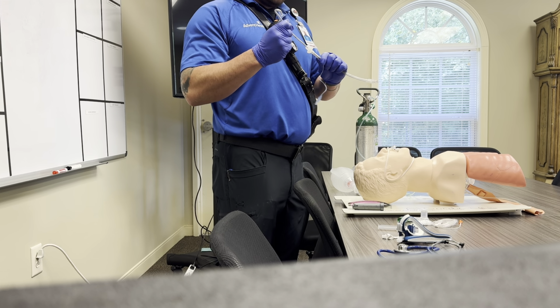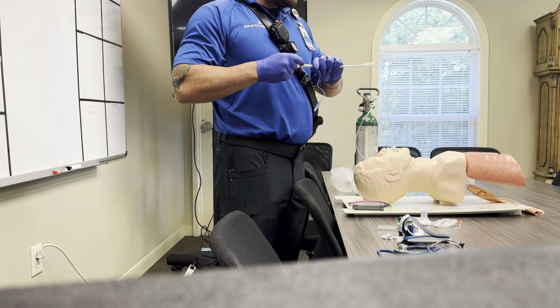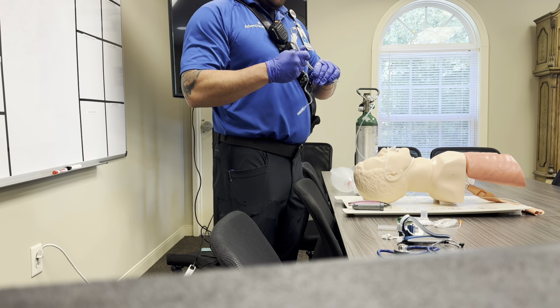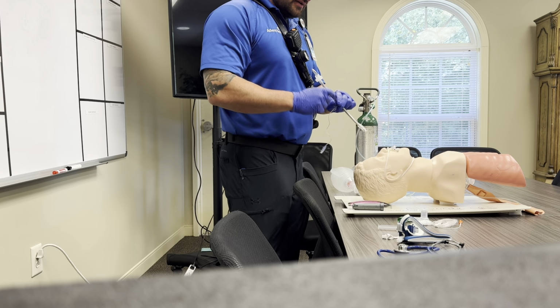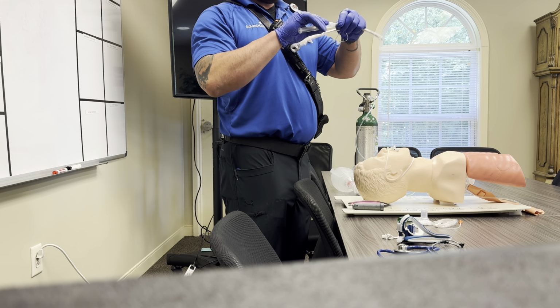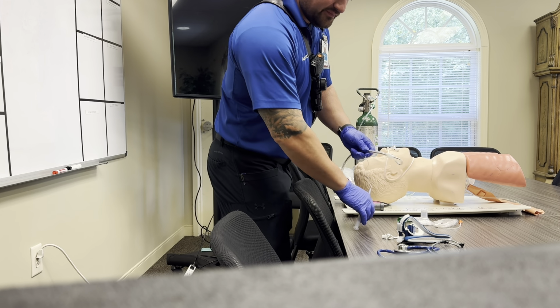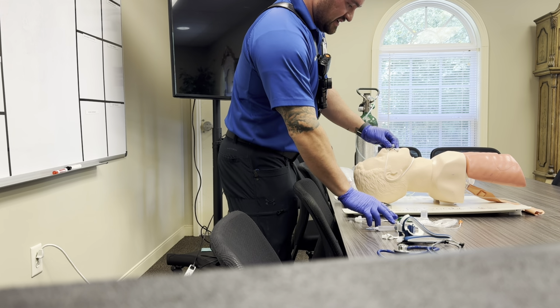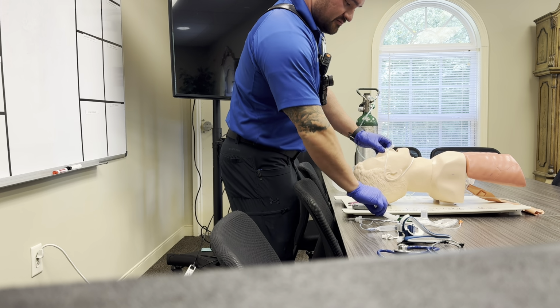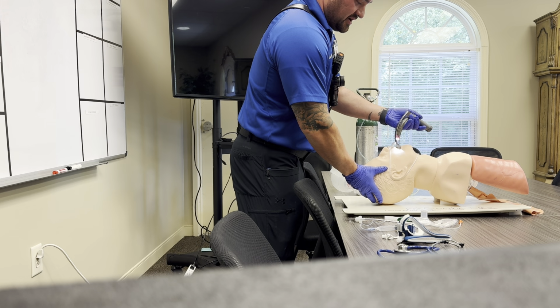It's easy to inflate. So we're gonna place our stylet just to the very end. And I prefer a hockey stick type shape. Okay. A trick that I like to do is go ahead and place my syringe on the end, but make sure that you're not pushing it, okay? So at this time, we'll have our partner stop with the BVM, remove the OPA, and then we want to appropriately open that patient's airway.